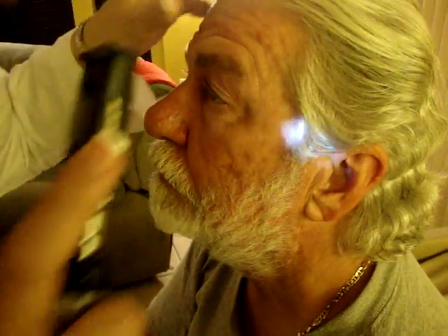We're looking for the red light reflex. Reflex, I'm sorry.